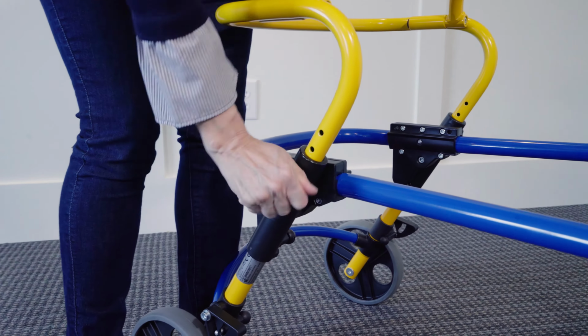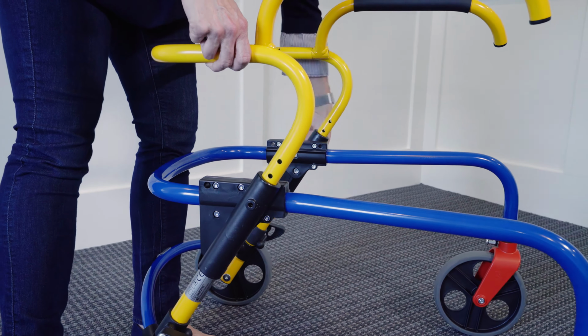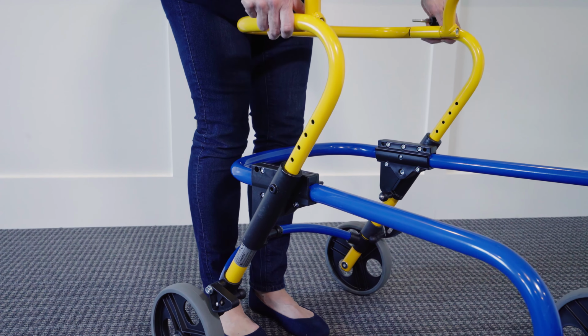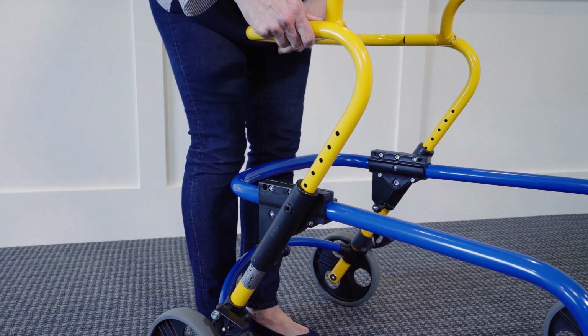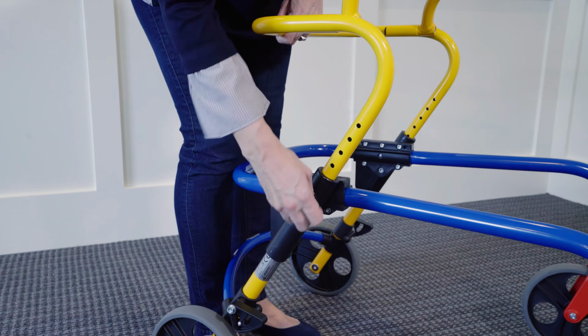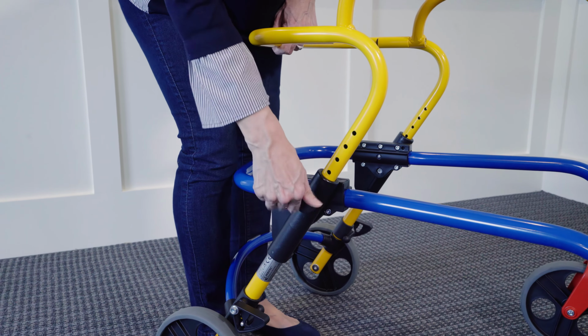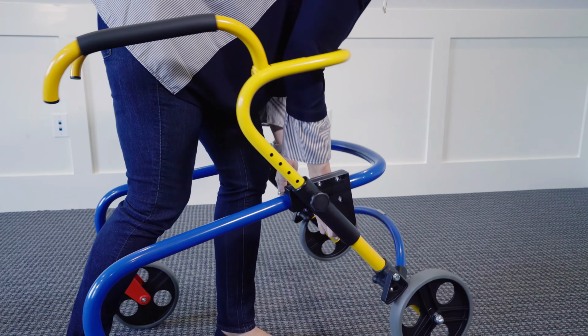You do not need a tool to adjust the height of the upper frame portion of this. And you just pull it out and it can go up and down all the way like that. And then you just put the pin back in and tighten it without any tools whatsoever. It can collapse easily with just pulling those two pins. There's also an optional seat that you can order to go on this.